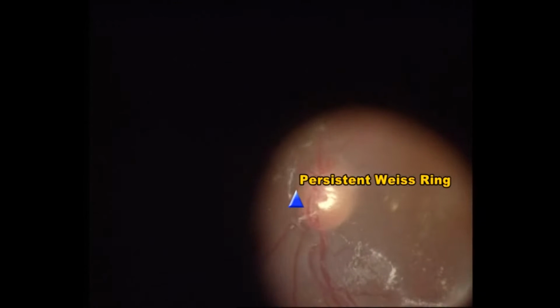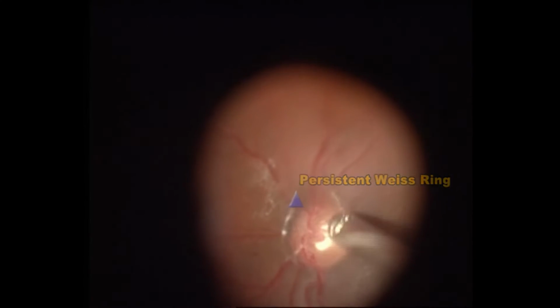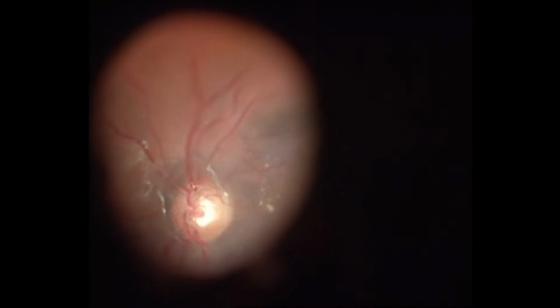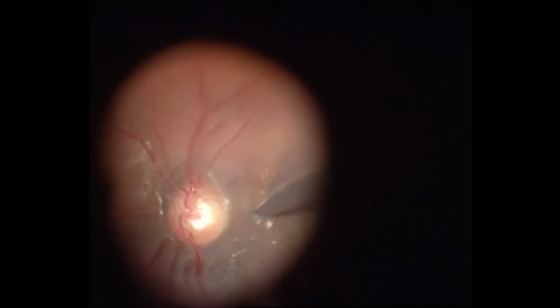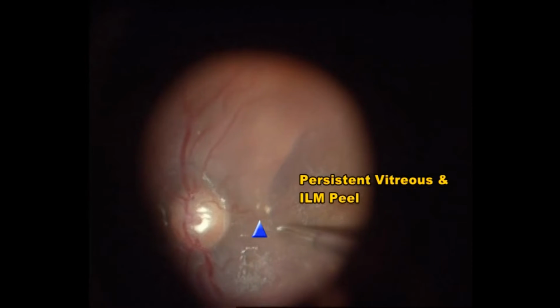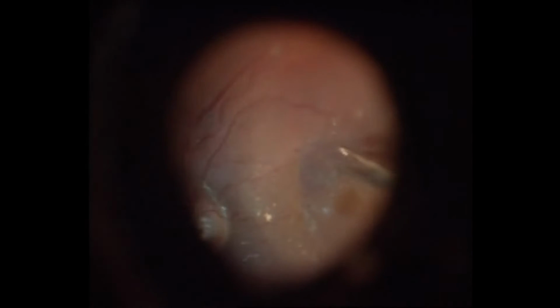However, the posterior vitreous detachment is incomplete and a persistent attachment of the vitreous to the optic disc is seen. There are also triamcinolone acetonide stained vitreous strands within the temporal arcade. The adherent vitreous strands in the macular area are peeled along with the internal limiting membrane. However, the thin strands of vitreous attached to the disc margin are left behind at the end of the procedure.